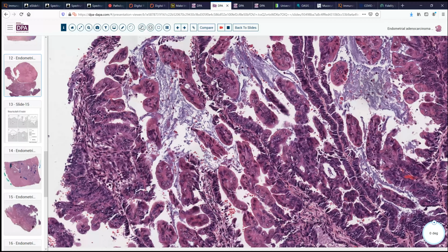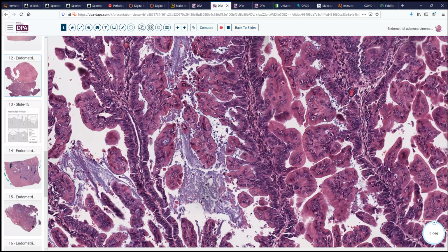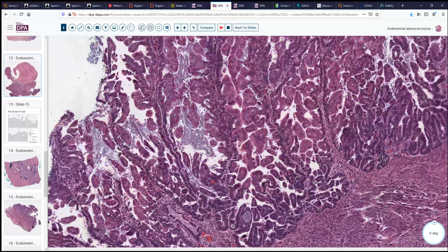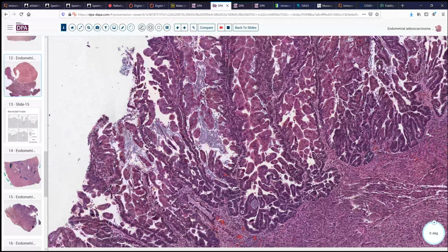Uterine papillary serous carcinoma has a papillary architecture or a small glandular architecture, but it also has high-grade nuclei. So what do we do when we have a disconnect? What I do typically is to look at the mutation status by testing with a p53 immunoperoxidase stain to reassure myself that these are still non-mutated micropapillary structures, but not papillary serous carcinoma. And so when you have that disconnect of architecture and nuclear grade, that is always a good idea. And in some institutions, it's fairly routine to do p53 testing on most, if not all, of their endometrial carcinomas to make sure that they aren't missing a mutation status for a potentially higher grade tumor.